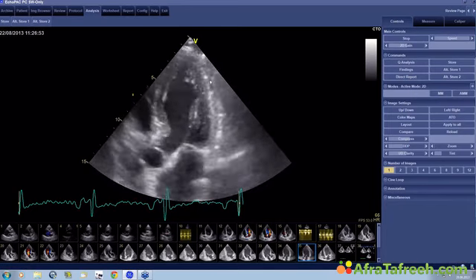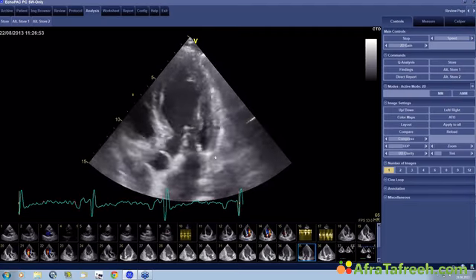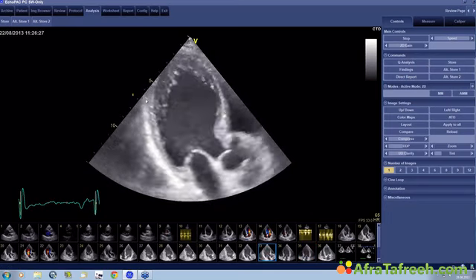So in conclusion, this is a fairly large infarct where we probably do have some viability because the myocardial thickness is still present here in the lateral region, while this here seems scarred.